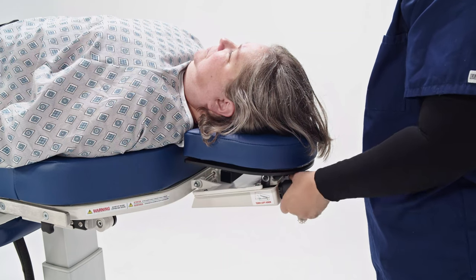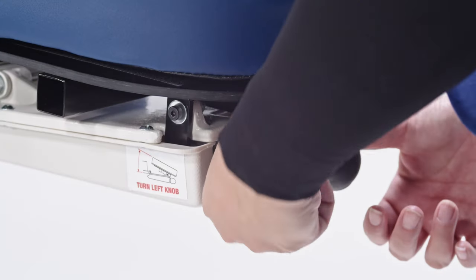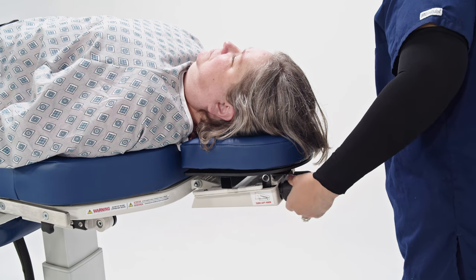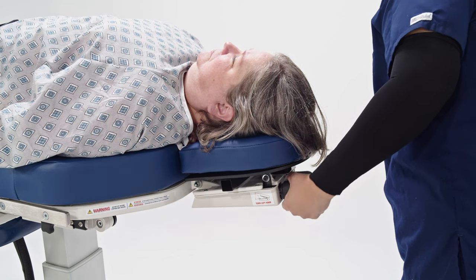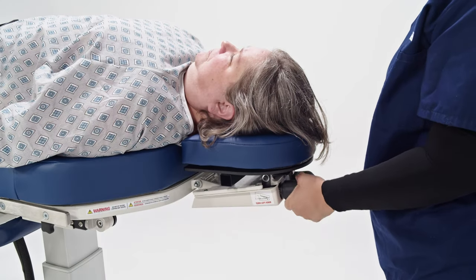The left knob is used for chin tilt motion. Turning the left knob clockwise will articulate the chin tilt downward, while counterclockwise will articulate the chin tilt upward.